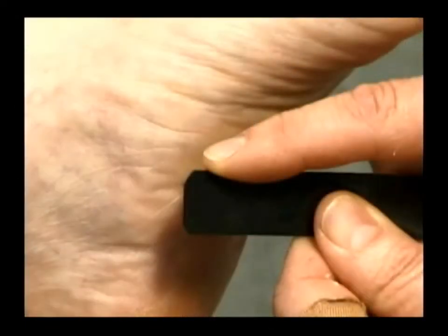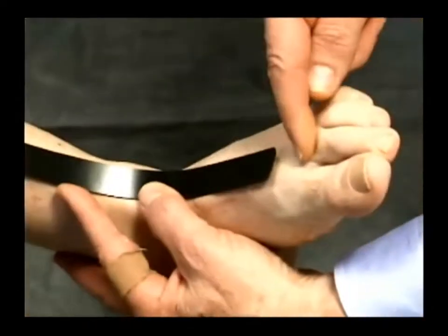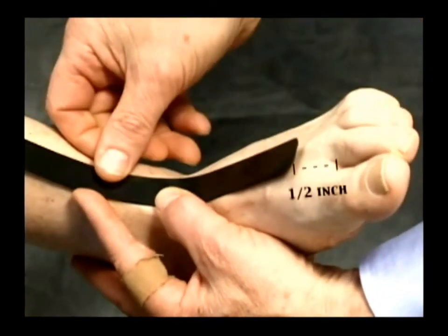Each cutting strip has one end with rounded corners. This end should be placed near the toes. It is important to position this rounded end of the strip exactly one half inch behind the space between the big toe and the second toe. The remainder of the strip is placed over the top of the foot, centered over the ankle joint, and directly over the shin bone or tibial crest.